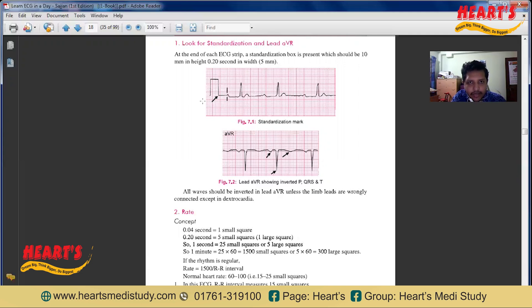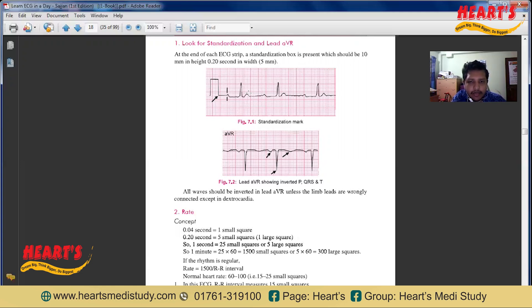If the waves are small and the standardization is 5 mm in height, then we can say it is a normal ECG. But when the standardization is 10 mm in height but the waves are small, then we can say this is a low voltage ECG. This can be found in obese persons, or when the distance between the skin and the heart increases — such as in pectus carinatum or similar chest abnormalities. Also, some degree of low voltage ECG is normal in females because of breast tissue.